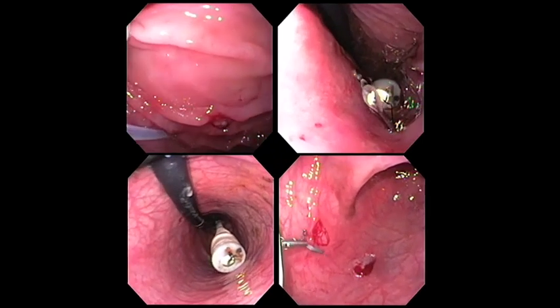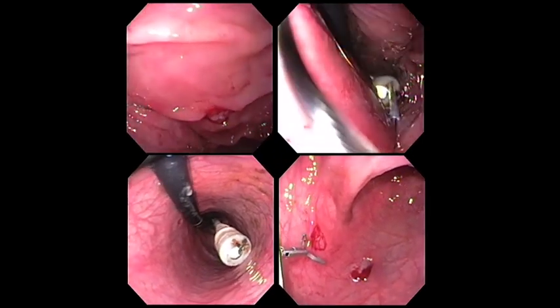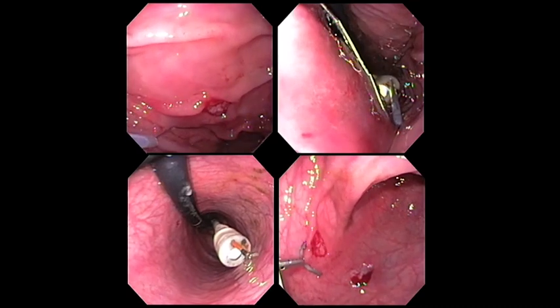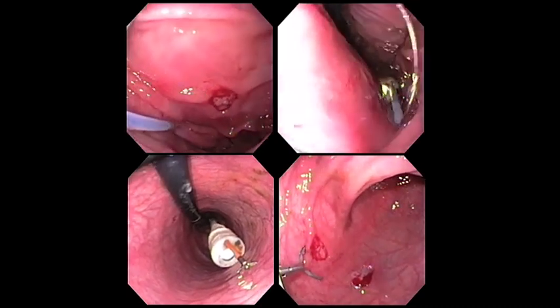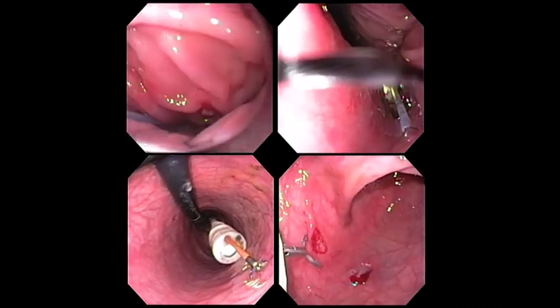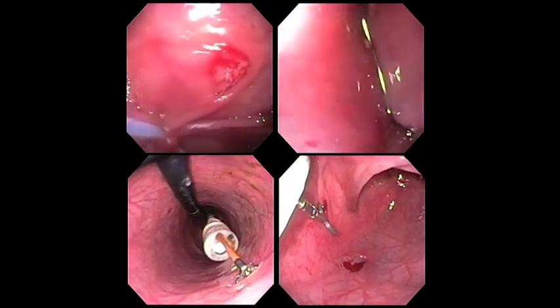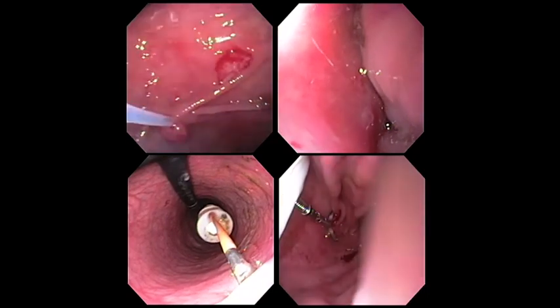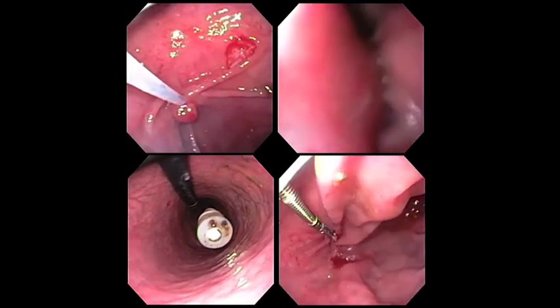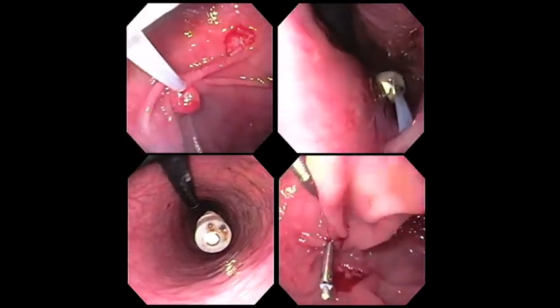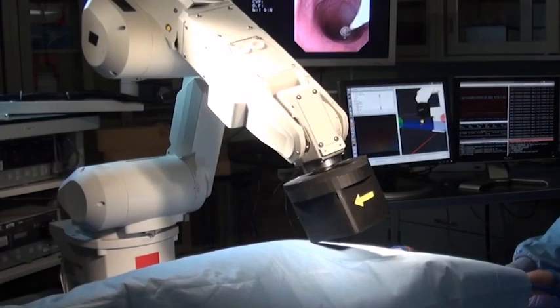Other therapies can be performed with the magnetic flexible endoscope. In the upper panes, we demonstrate cold snare polypectomy. In the lower left, we see use of cold biopsy forceps. And in the lower right, we see successful placement of a hemostatic clip.